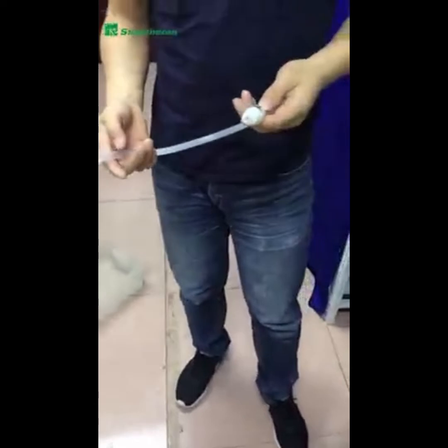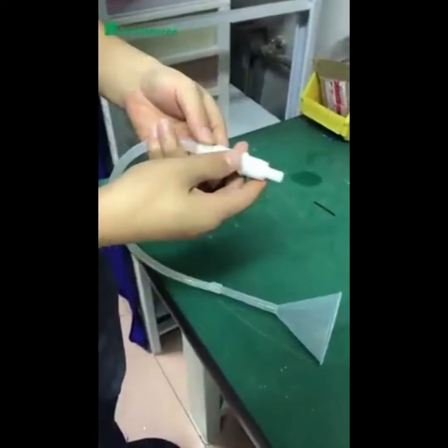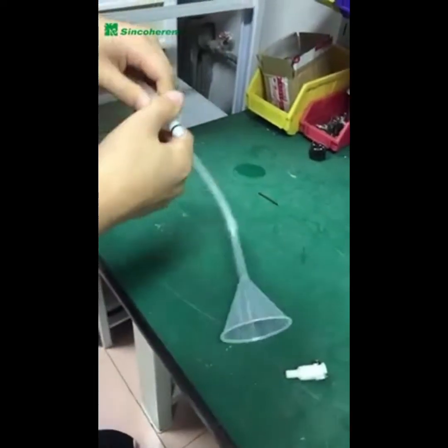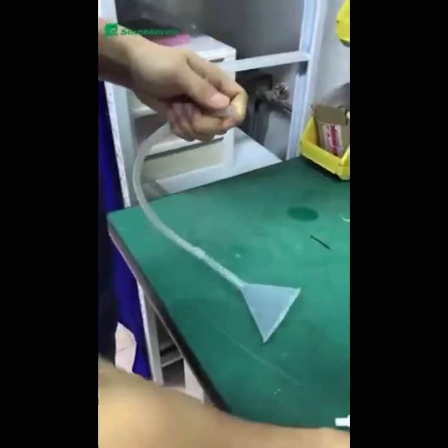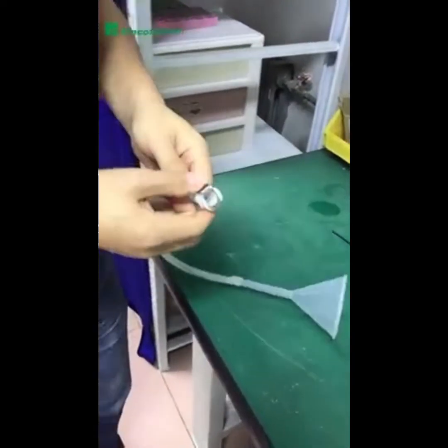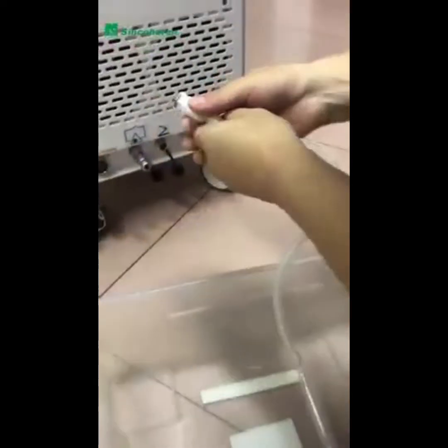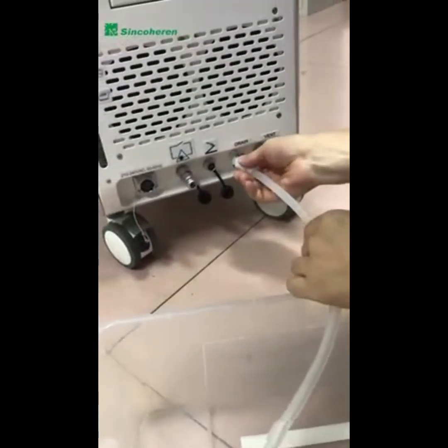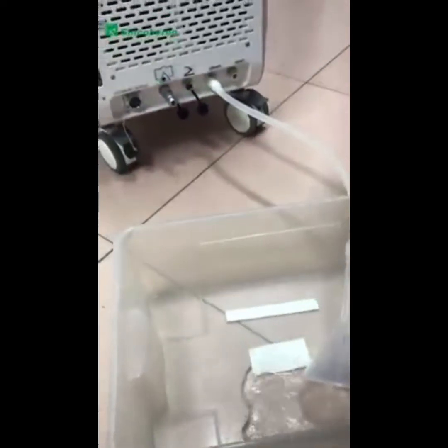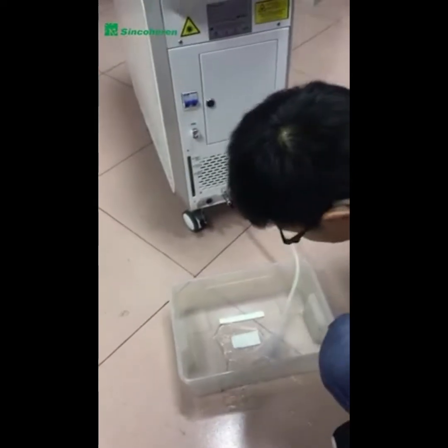To drain the water, get the pipe from the electrical water filling device and take one part from it. Connect it to the drain position and pour out all the water. We suggest changing the water every one to three months depending on your operation frequency. Water must be distilled or purified water. If you don't use the machine for a long time, it is better to drain it.